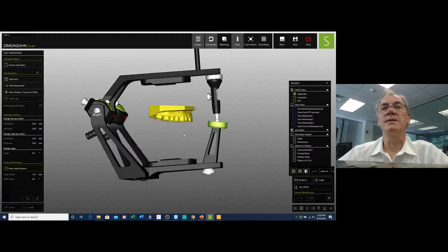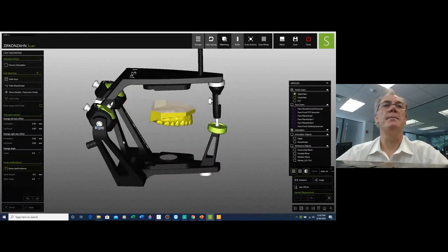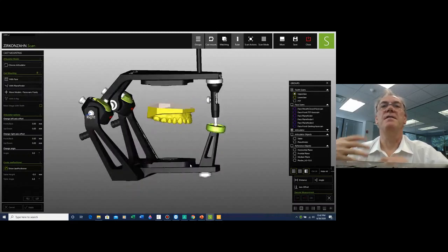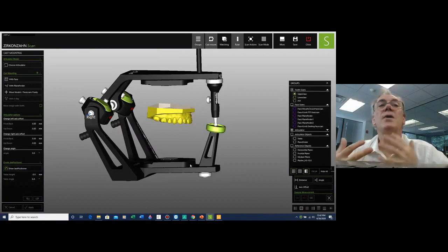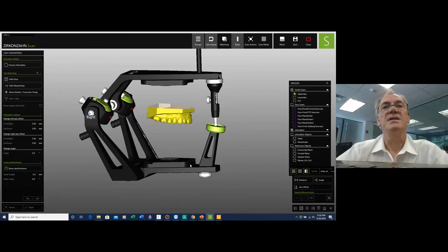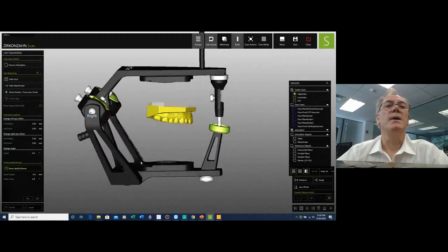into a physical articulator. Well, there again, the guys that worked on these programs did an amazing job in finding these solutions, because they are really very important and they are fundamental. I'm one of those that works, yes, on the digital articulator. It makes my life easier, but the final execution or the final case is going to be checked anyway on a physical articulator. So I do have them always mounted digitally and then physically. It's really very, very important for me to have them both to my disposal.